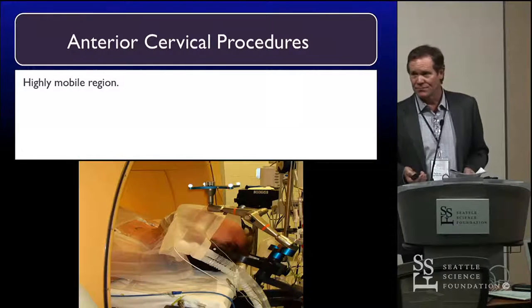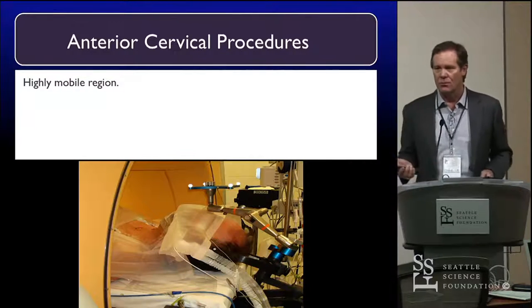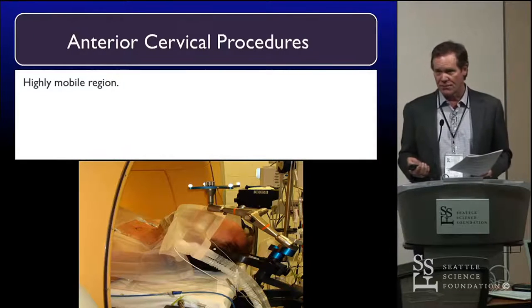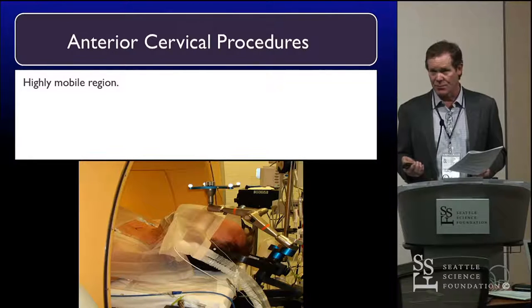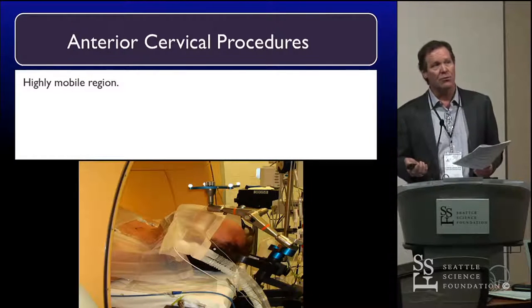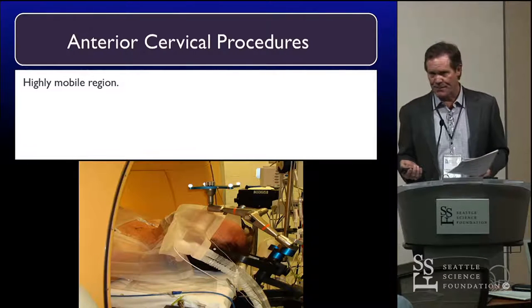Anterior cervical. Well, it gets even less, but we use it there. So people ask me, do you use this for an ACD? No. Would I use it for some complex cervical case that we need to go from the front side? You bet we do. And we'll set it up just like this, and we'll put a Mayfield on the patient, even though we don't even necessarily hook the Mayfield up to the table.